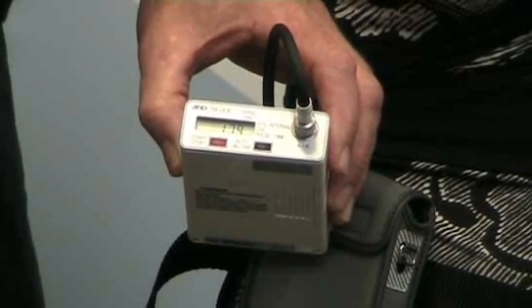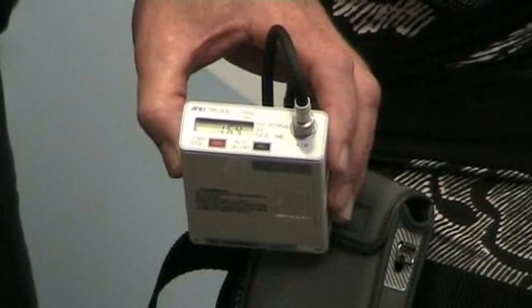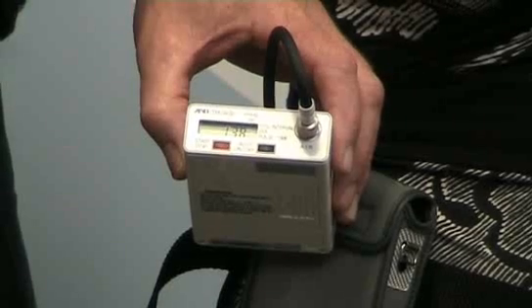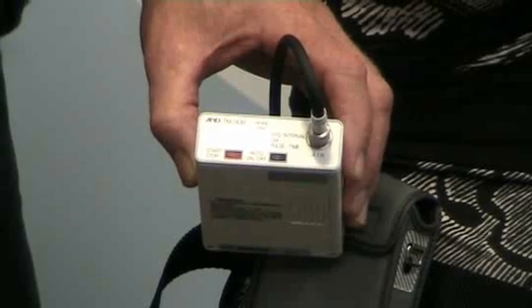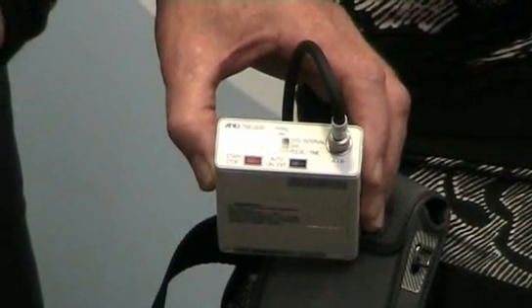Once in automatic mode, the inflation rate is adjusted according to the average of the last three readings, so hopefully as the patient's blood pressure drops at night the inflation level will reduce and hopefully make it more comfortable for the patient. It's fully automatic so it will always adjust itself to the correct level.